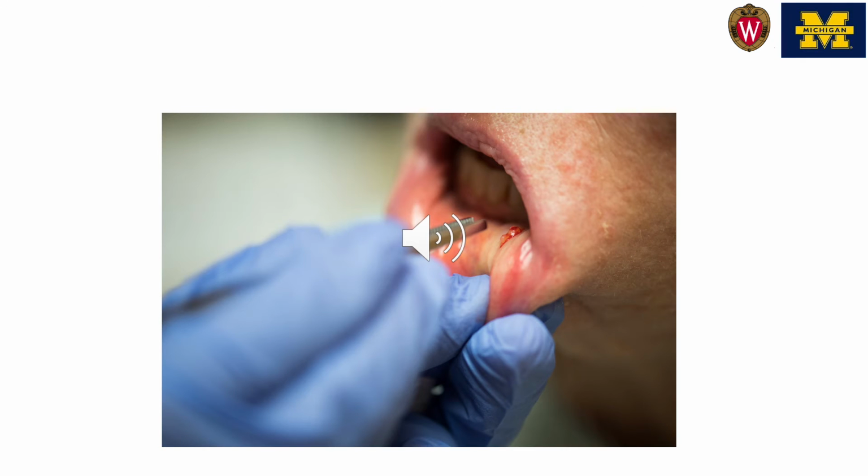subcutaneous, submucosal nerves in the mouth, and they all run vertically. So if you slash across horizontally, you run a much greater risk of transecting some of those little nerves than if you do, like both of us do now, is to incise vertically. It's a little bit fussier because you can't spread the tissues apart quite as easily as with a horizontal incision. But it's worth it for the amount of anesthesia, dysesthesia you avoid by not transecting those nerves.